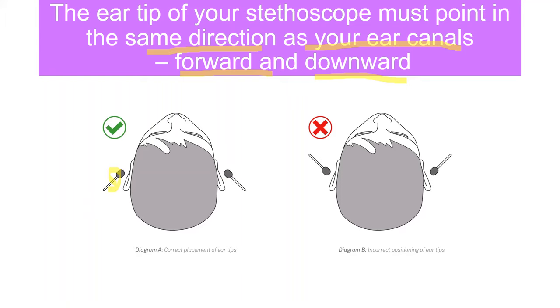Here you can see the eartip is pointing forward and downward, which is the correct method of placing the eartips on the ear. This is the wrong way. It shouldn't be placed in the opposite direction. This is the right way of placing it, forward and downward, the same direction as your ear canals.